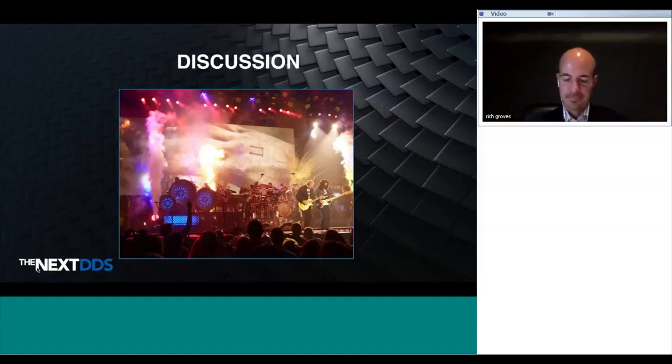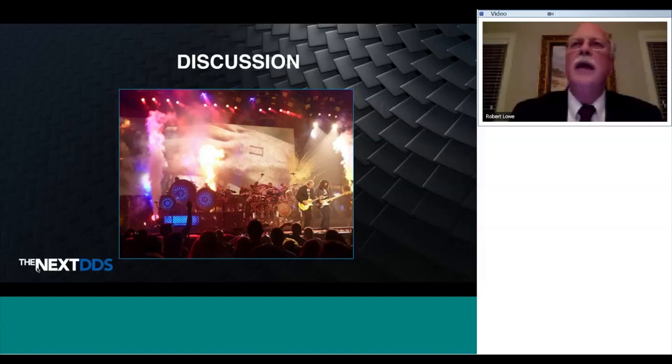There are a couple of different schools of thought on that. First of all, I don't use chairside milling. I'm not against it. I think chairside milling is one good option for indirect technique. I still use a laboratory process for the majority of my restorations, although some of them are made from traditional impressions and some of them are made from cameras, or optical impressions. Remember though, when you make an optical impression, it's still a picture, it's 2D, which is why I think that the preparation design is even more critical, that irregularities are even more of a problem.